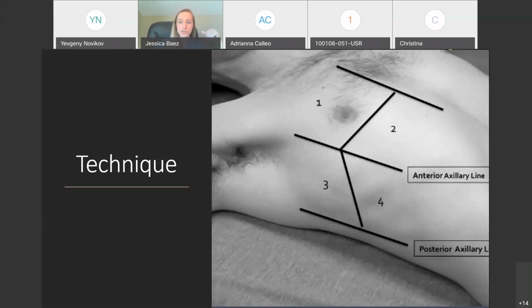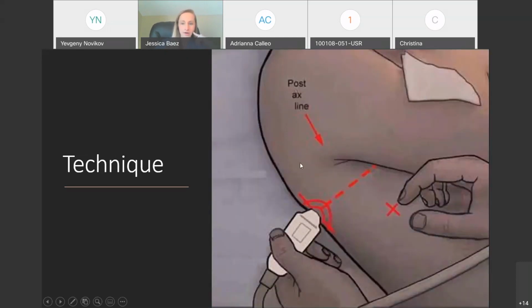Generally in the emergency department, we do a 10-zone scanning technique. So we do 2 zones anteriorly on each side, an upper lung and a lower lung, 2 zones laterally on each side. And then in addition, we do an area called the PLAPS point. This is something that was proposed by Dr. Lichtenstein, who I mentioned earlier, as the highest yield point on lung ultrasound, because this is the most dependent area in the thorax.